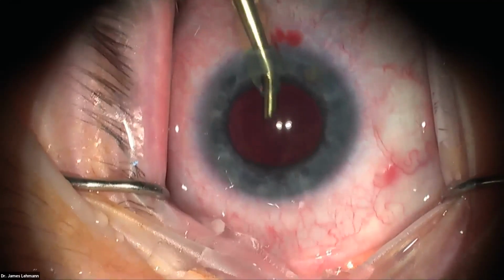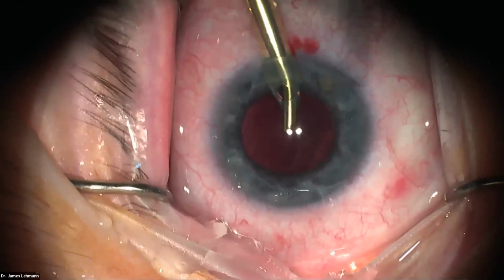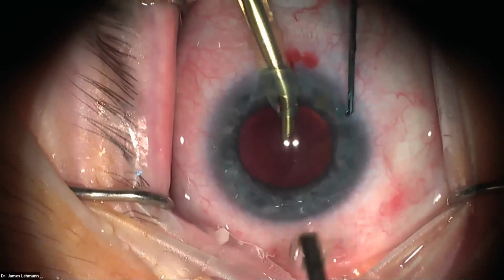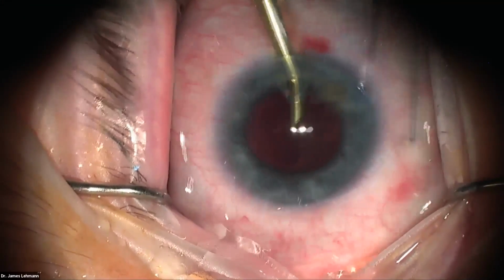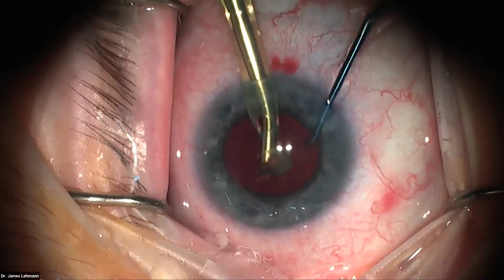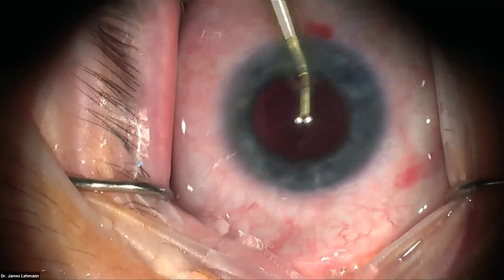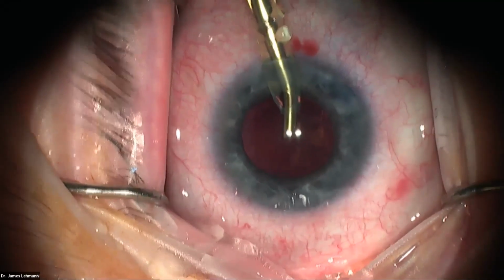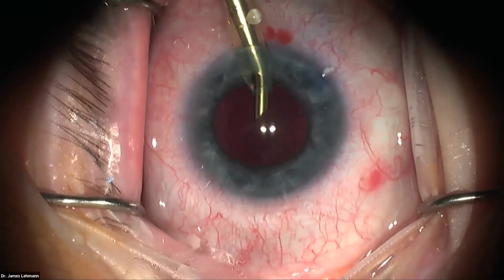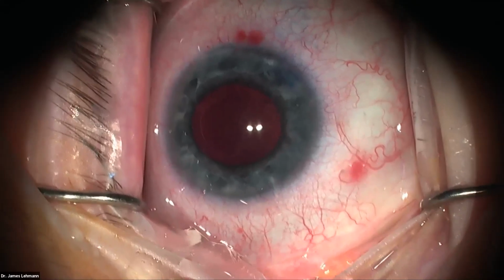And now, not much cortex, but you can see there's a little part of some nuclear fragment that looks a little too dense to eat with just the tip. So I'm going to put this instrument back in and kind of try to nudge it into the center, and then put it back on the tip here and eat that. All right, and so now I kind of look around, everything looks okay. So I'm going to turn off my continuous infusion. Continuous irrigation off. And then I come out of the eye, and no iris prolapse, so that's nice.